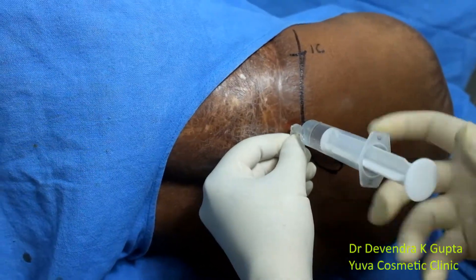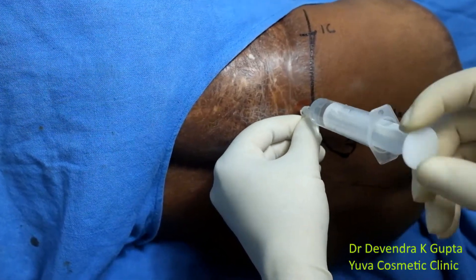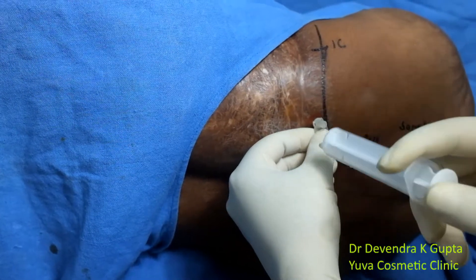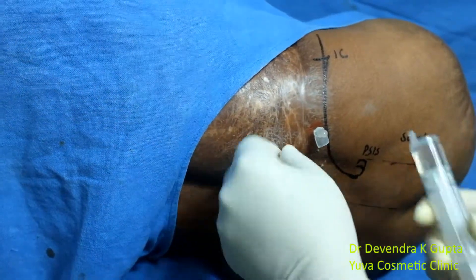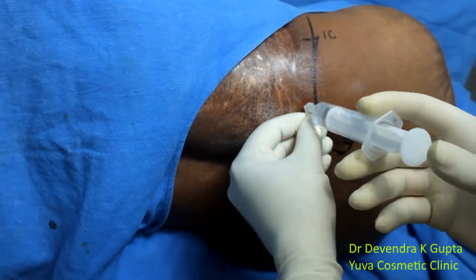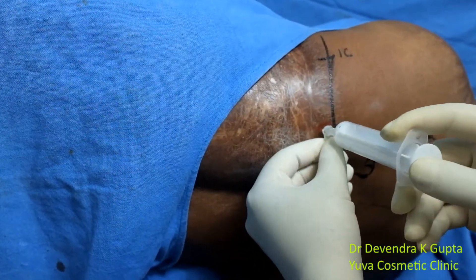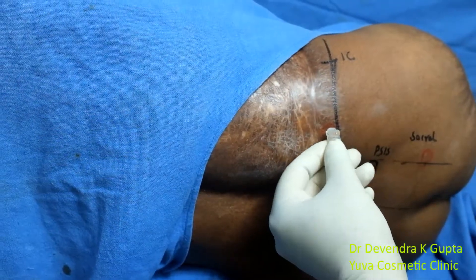Aspirate the needle again, then rotate and aspirate once more. Now this is in the proper plane. I have taken 5 ml more and injected the solution, so the total volume given is 25 to 26 ml. You can notice the slow regurgitation here, confirming that the injection has been given in the proper plane.